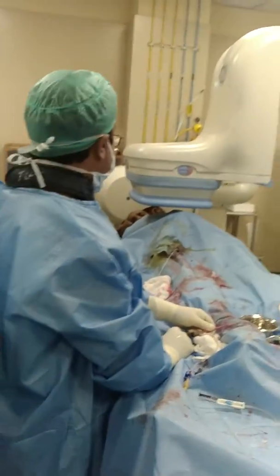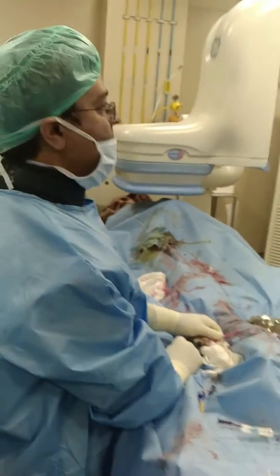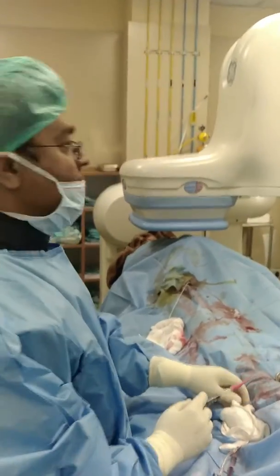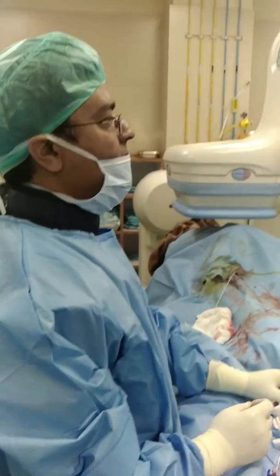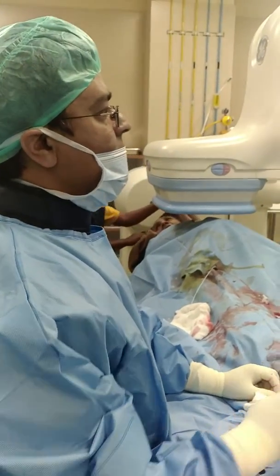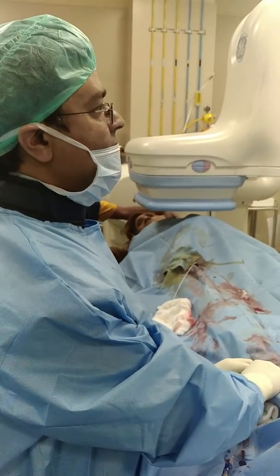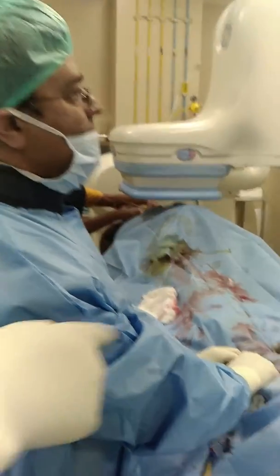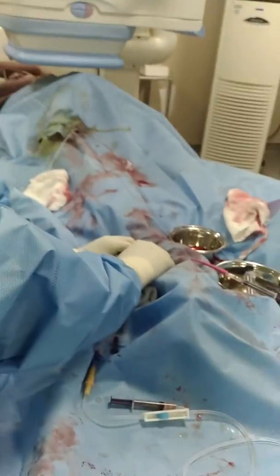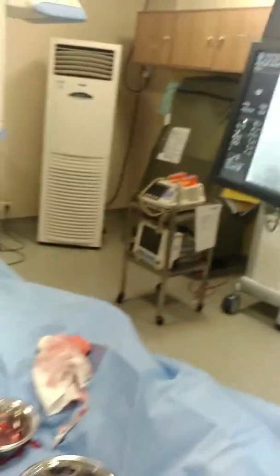Getting a little relaxer — she's tired. She doesn't have pain, but she's tired. So we have finished this part and we would just like to come out of it — done. Fair amount of stasis, removing it, just as you can see.